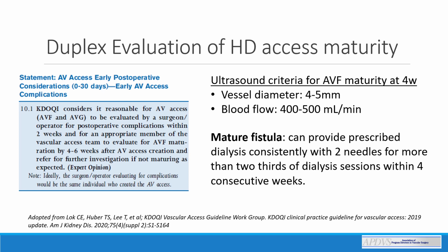Now, I will discuss the role of duplex ultrasound in assessing HD access maturation. For obviously mature fistulas, clinical examination by an experienced nephrologist or dialysis nurse is sufficient. KDOQI recommends duplex ultrasound examination if the physical exam is equivocal. This will help evaluate for causative abnormality and assess fistula maturation progress via AVF diameter and blood flow measurements.